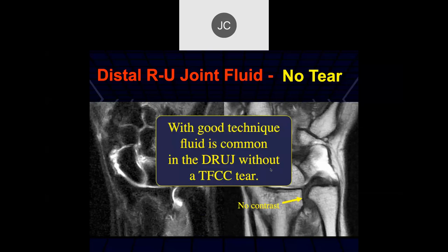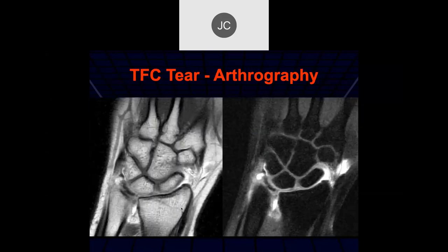This is one thing to remember: with good technique — compared to the kind of technique we did back in the 1980s — with modern MR imaging, it's not uncommon to have small effusions within the distal radial ulnar joint which are not necessarily pathologic. Here's an arthrogram where contrast is extending into the distal radial ulnar joint space, consistent with a communicating tear.